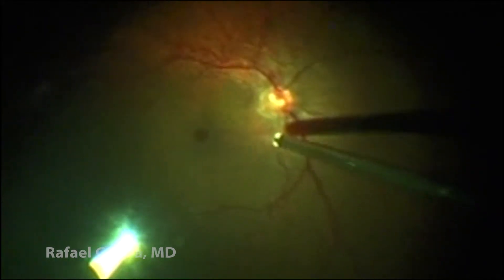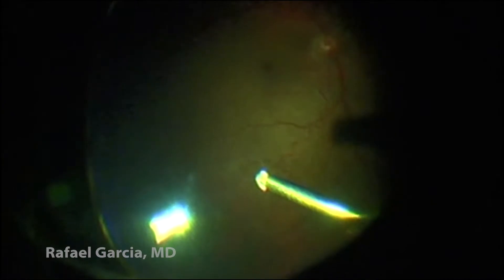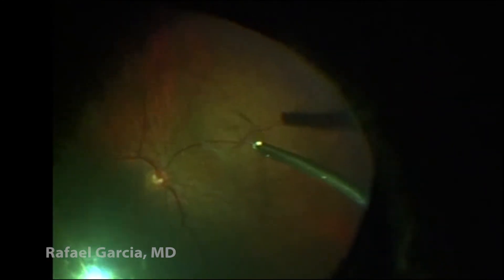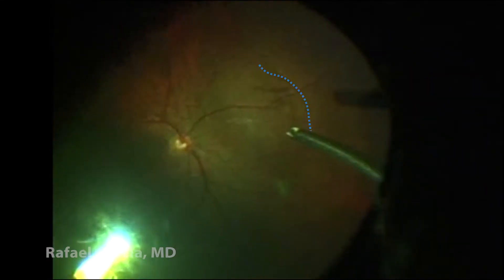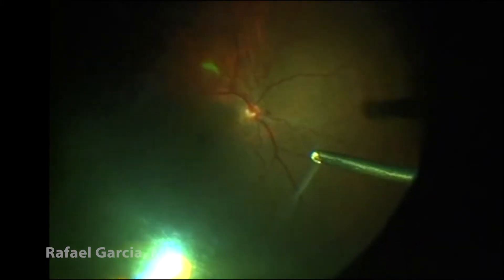Next, we go down to the optic disc to perform a posterior hyaloid detachment. Here we can actually see the Weiss ring, which implies a complete vitreous detachment from around the optic disc. In the nasal quadrant, it's possible to see a wave-shaped image as the posterior hyaloid is being pulled up with the vitrector using high vacuum settings.